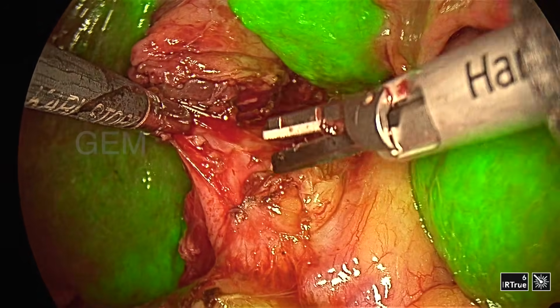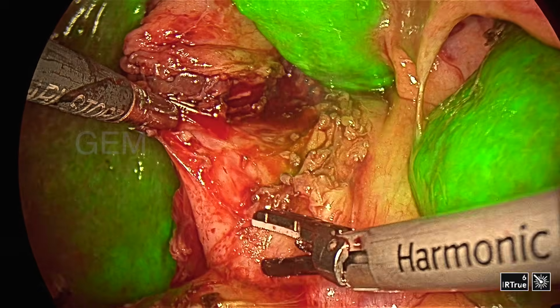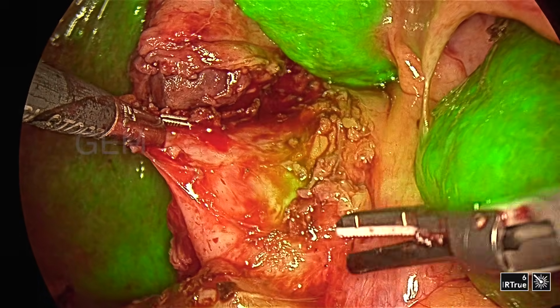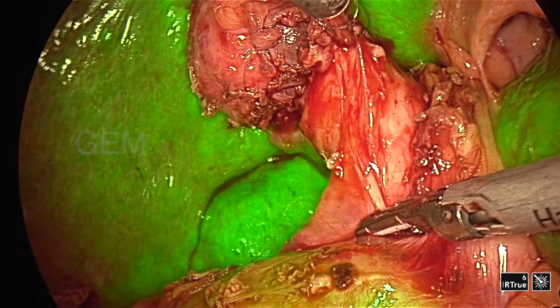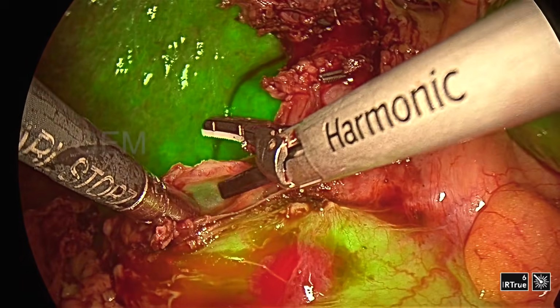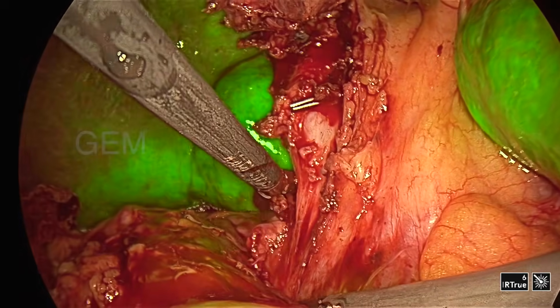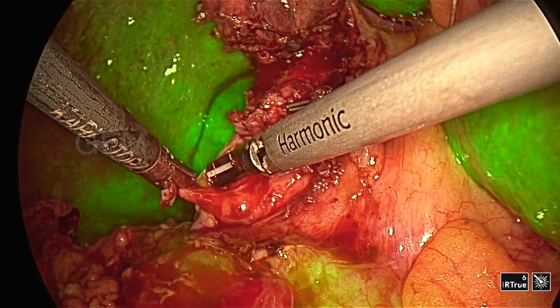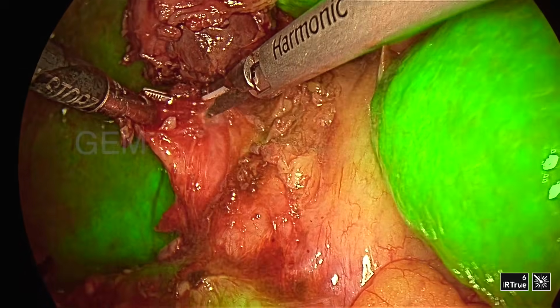So how much medial do I have to come? You can see the ICG is helping me, so I cannot come this side. I have to go on the lateral side, otherwise I will injure the CBD. So I feel the real use of ICG in this case, and that ICG IR mode is helping me a lot. Each and every dissection or division of any structure, I am seeing in IR mode. That will be very helpful.